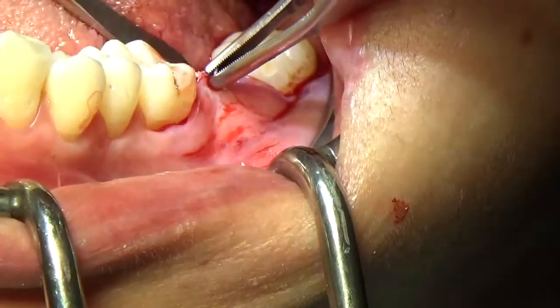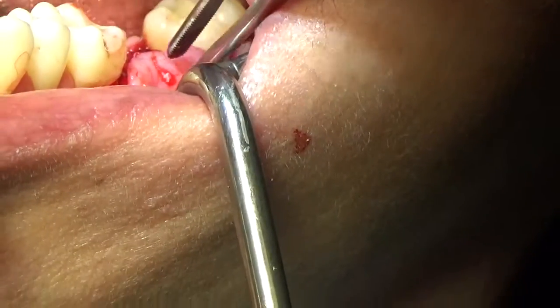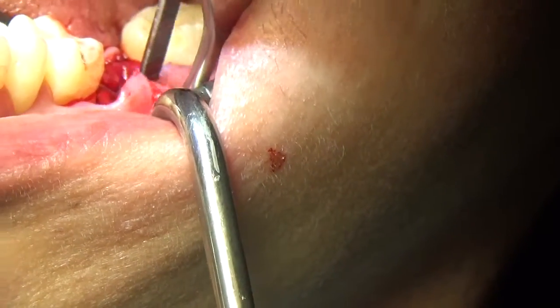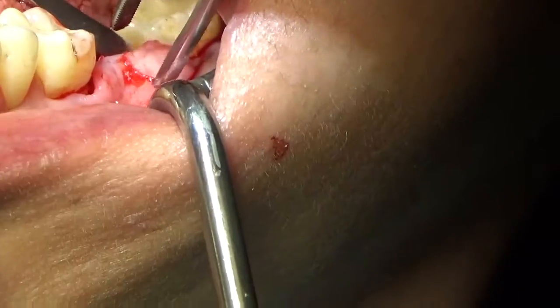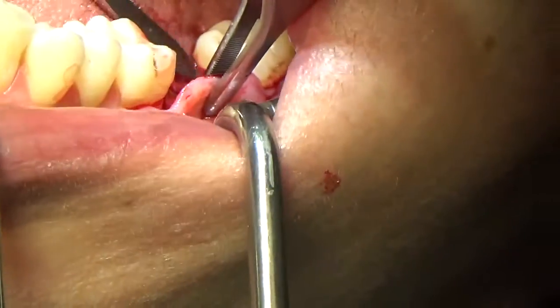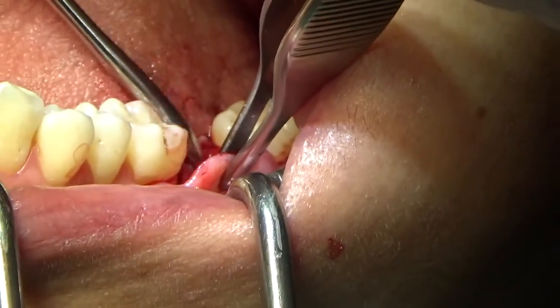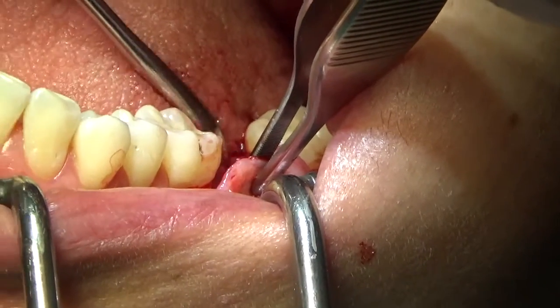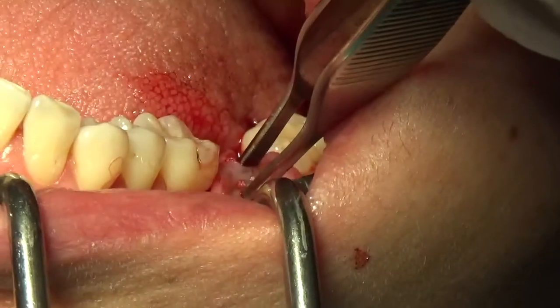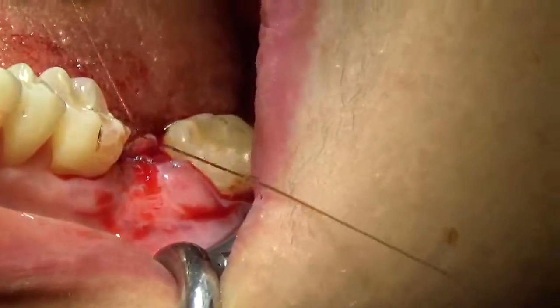So now what's going to happen is, like I showed with the mobility of that flap, it's probably not going to close all the way. Do I need primary closure? No. But I was giving it a little something just to help it out. I'm not going to get fancy with the sutures either, because simple interrupted sutures should do a nice job in this area. Do a horizontal mattress suture to try to close it a little bit better, but in this case we're going to get good results by KISS. Keep it simple, stupid.